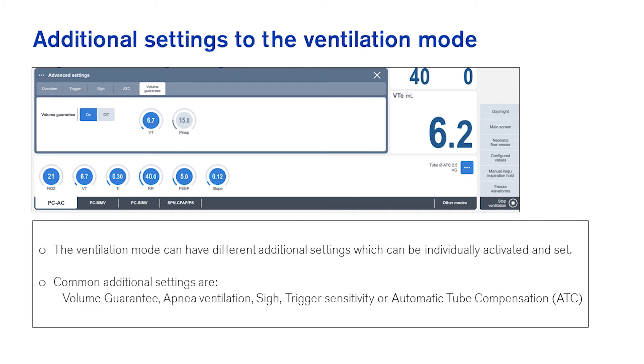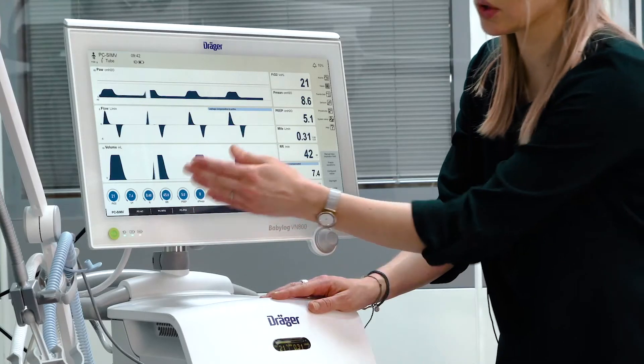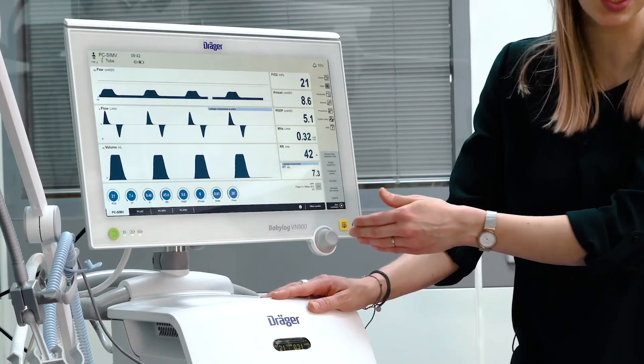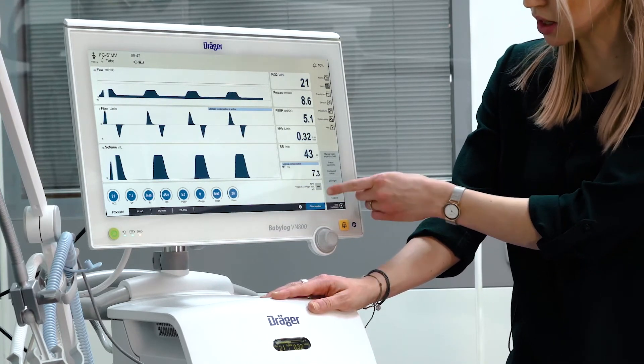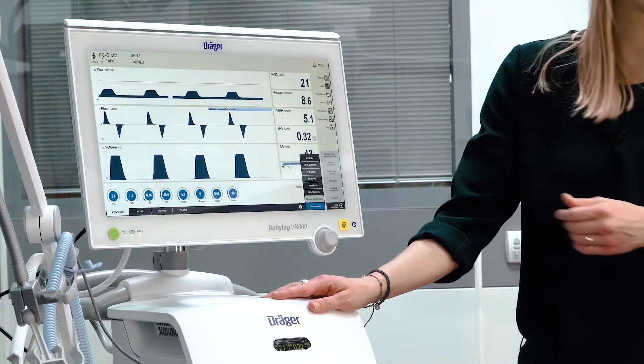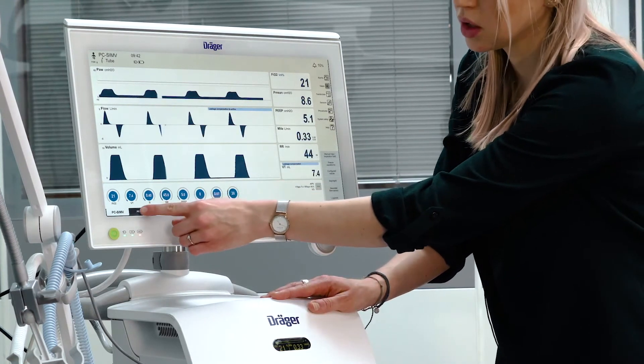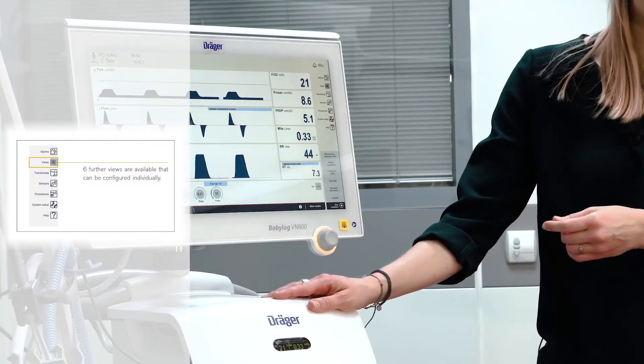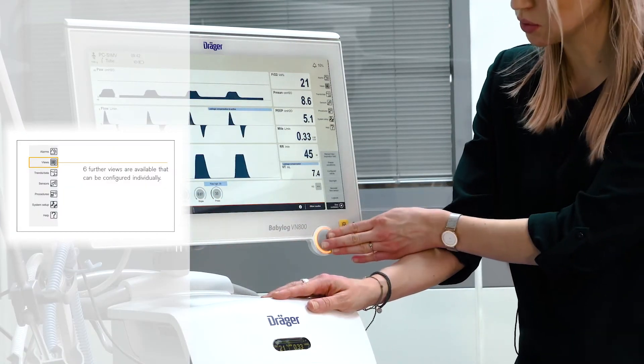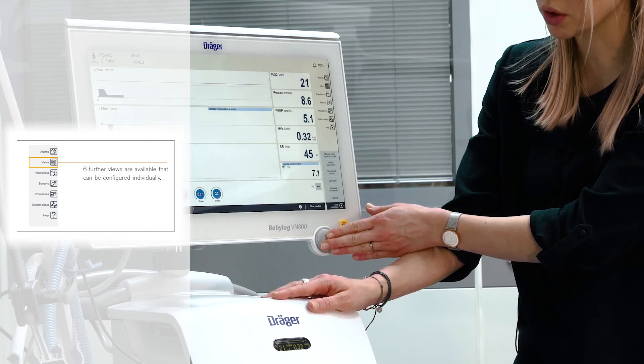If you want to switch to a different ventilation mode, you can choose a ventilation mode from the pre-configured list or you can enter other modes where you will find further selections. To change the ventilation mode, select the respective ventilation mode and confirm by pressing the rotary knob.